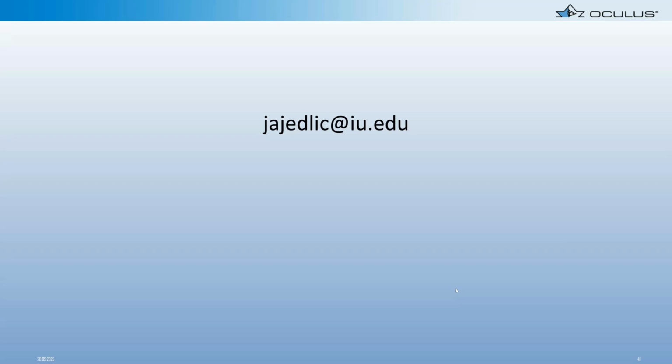As far as doing a Pentacam at follow-up, I would be more than happy to do one at every follow-up, but it's probably not necessary if I've got a keratograph. Personally, I like to do the keratographs at follow-ups for the first few months, and then I will probably get a Pentacam again at 6 months, and then yearly we'll do both instruments again. I don't do both at the first 3 months of follow-ups, just to save the patient doubling up every single time.